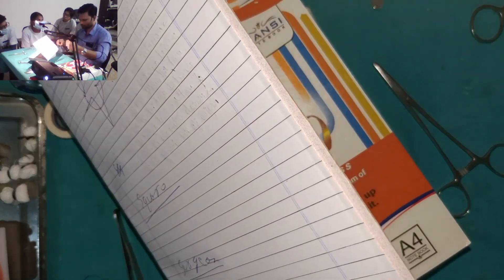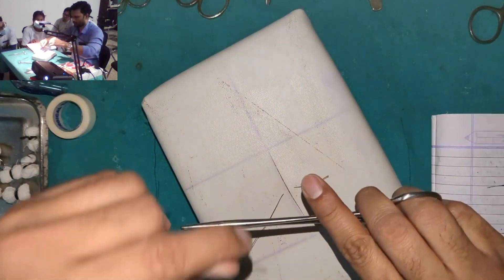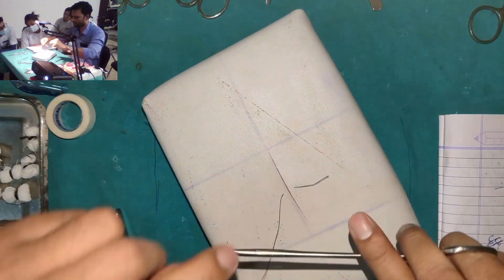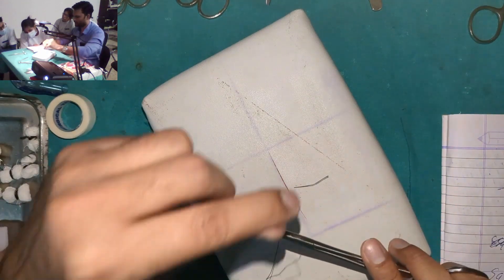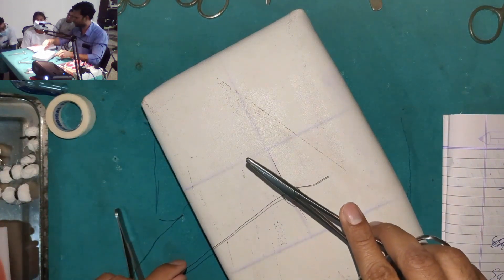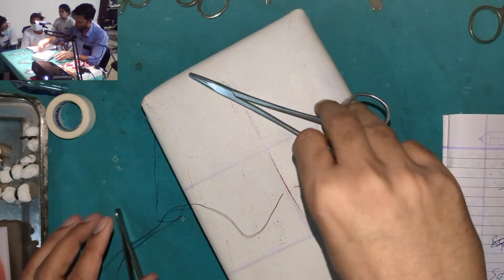So square knot, what happens? This act is called a throw. The thread that we're placing over the needle holder is called a throw.